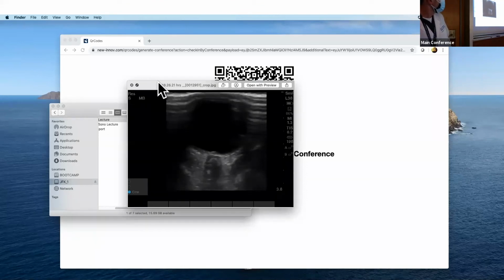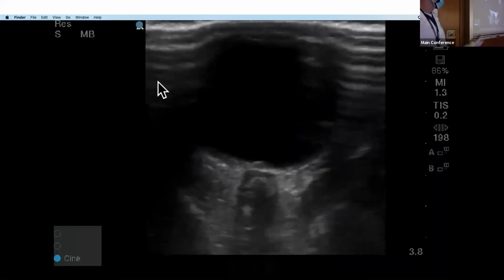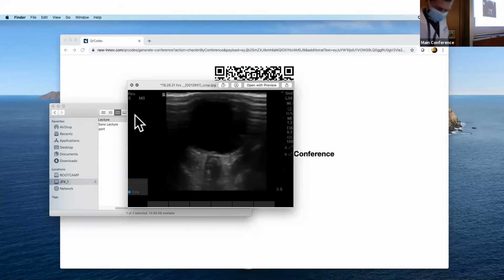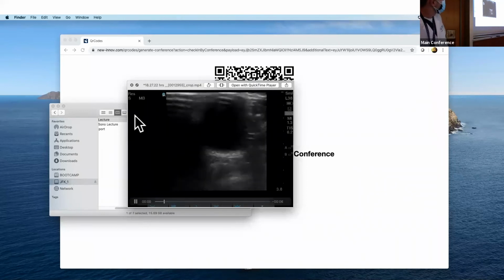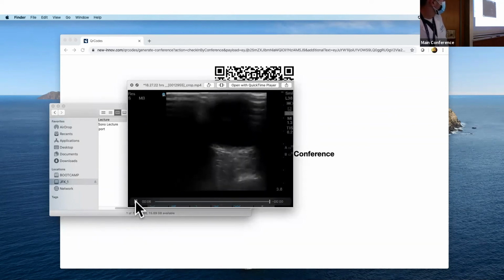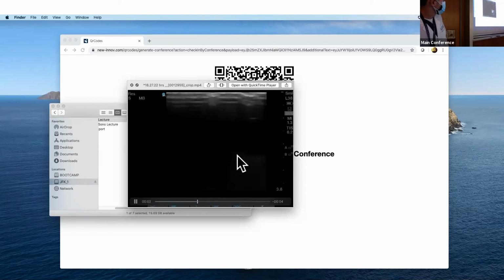Now we're seeing the optic nerve right in the middle, and as far as the sheath, hypoechoic on the outside. Measuring it out, you have 0.3 back, going across into the other, 0.62. It seems to be positive. Then we have the papilledema on the other side as well, the other eye is there.